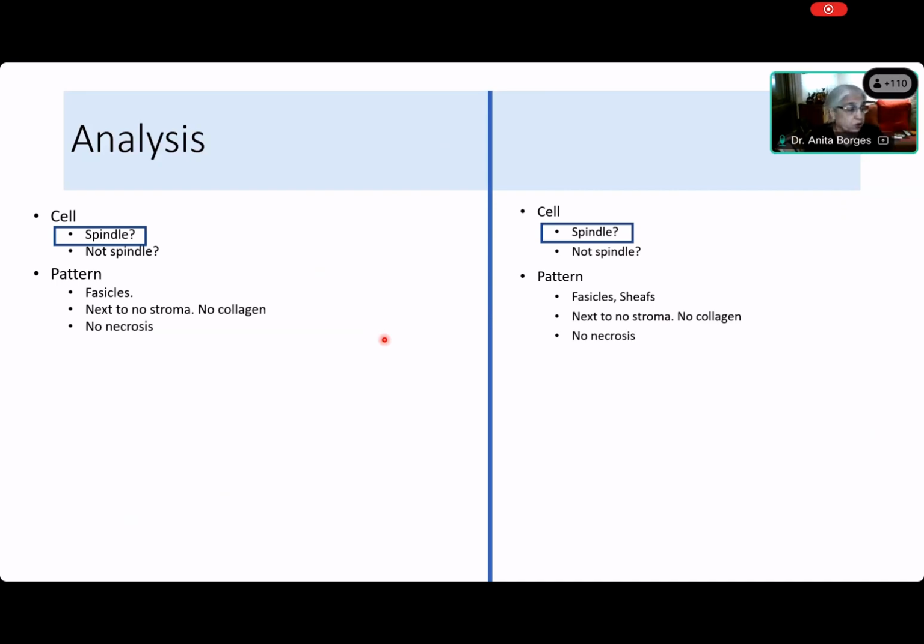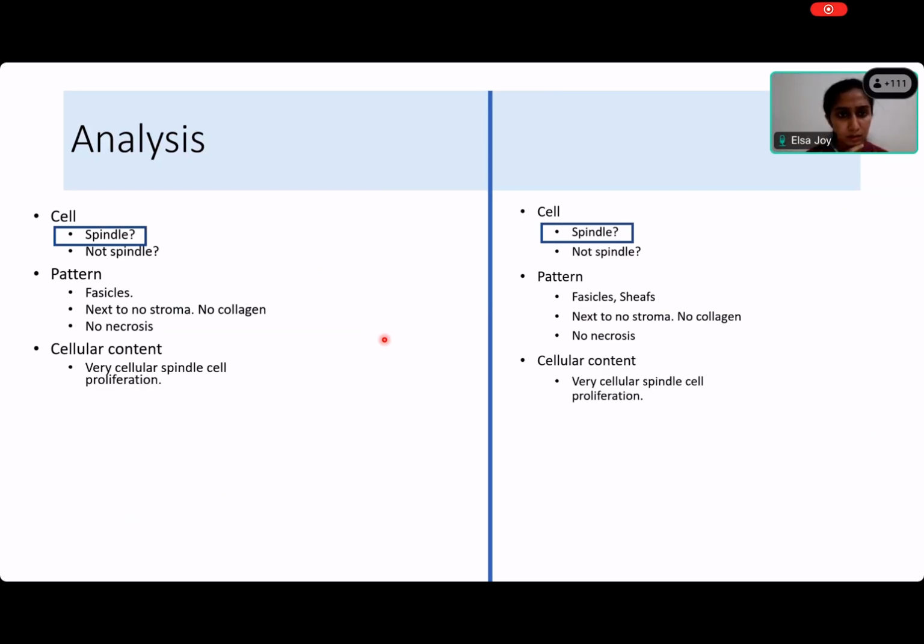Okay. And the other thing that we should look for when we have very cellular tumors is necrosis. There's no necrosis in this tumor. Now that's very, very odd for a cellular spindle cell tumor. But there are some other things that are odd. Okay, what is the cell content? Spindle. It's an extremely cellular spindle cell proliferation. Yes, very cellular. And did you notice whether there were any mitoses? Very few. Extremely few. Now here is a very funny thing. There's no necrosis, and mitoses are very few, and yet the cellularity of these two tumors is exceedingly high.